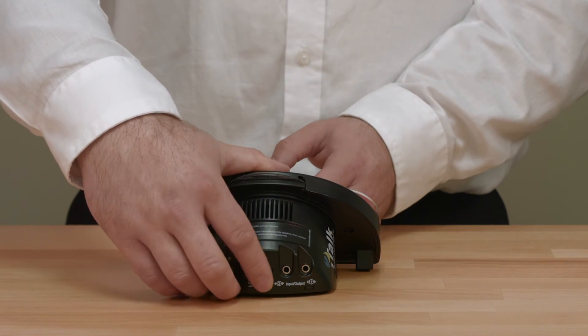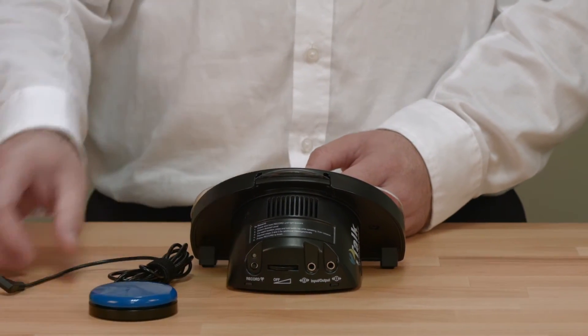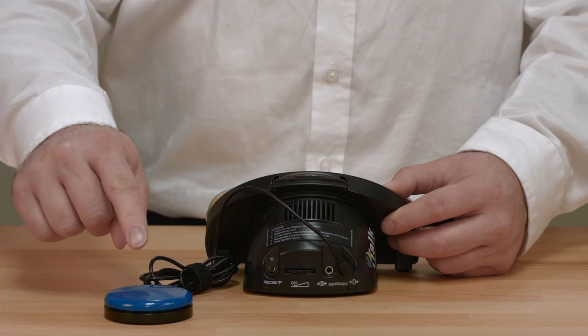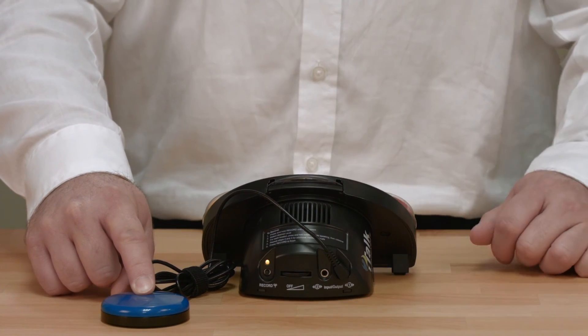First, turn the iTalk 2 with Levels off. While the iTalk 2 with Levels is off, insert your switch plug into the corresponding switch jack on the back of the device. Hold the switch down so that it remains activated and turn the iTalk 2 with Levels back on. Your switch is now ready to use.